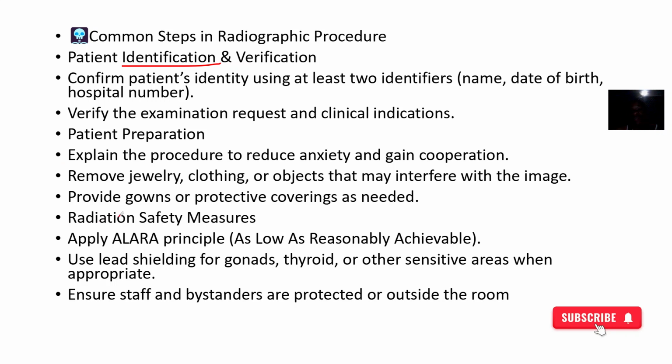You also make sure that they have removed any jewelry, they don't have keys in the pockets and all of that. You provide the special gowns, those gowns that are disposable, for the radiology.